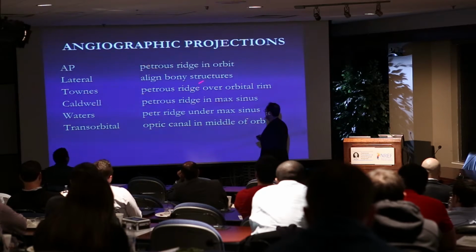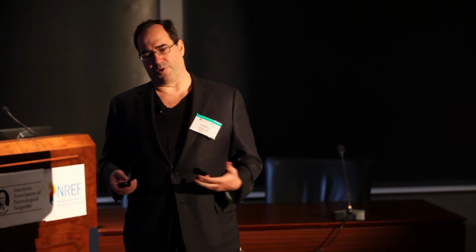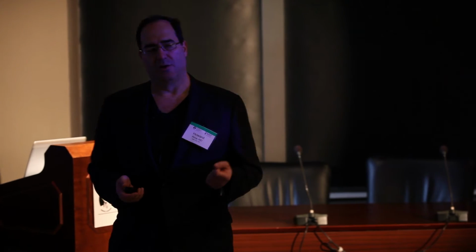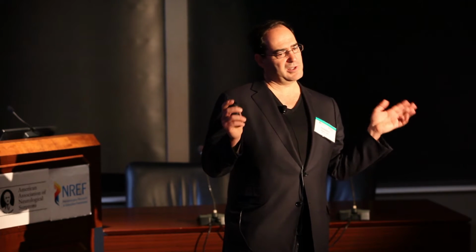Whenever I am sitting in vascular conference and I'm often looking at outside angiograms, the first thing that I'm always struck by is the number of times that I see that people don't start their angiogram and their angiographic analysis with standard views. This is something I learned from Dr. Bernstein way back when, and that is always start with AP and lateral images. I can't tell you how simple that is and how important it is and how often you see that it's not done. Start with simple AP and lateral views, and then you can get fancy with your complex views.